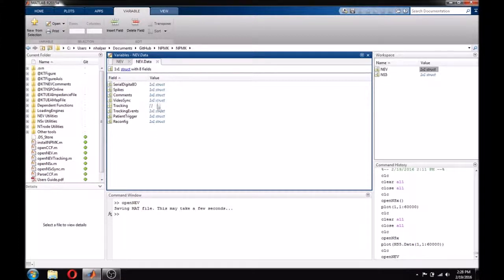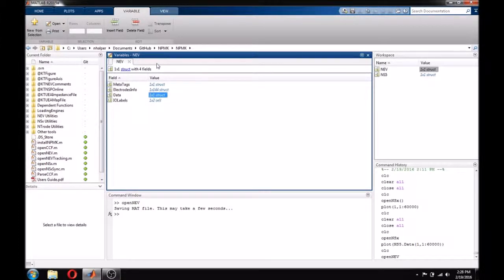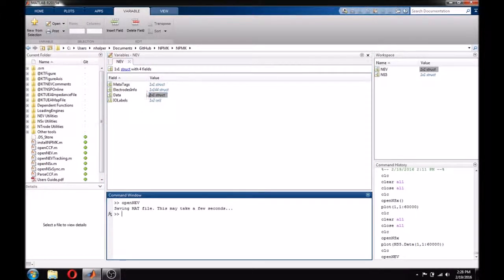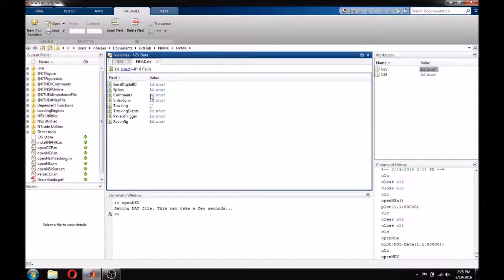IOLabels generally does not need to be dealt with. It contains some titles that are used in other places in the NEV structure. Let's look at the data structure, since that contains all of our new information.